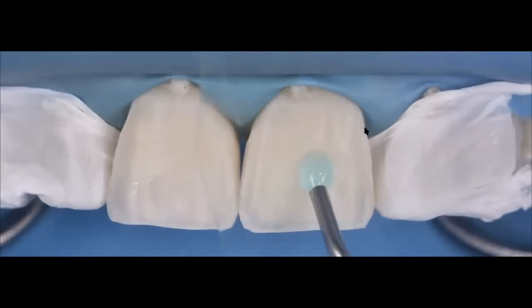And you can see here now I've removed everything. I'm adding a Teflon tape on one side. You can see here on 7 and 10 Teflon tape, and right between 8 and 9 I'm using a Mylar strip, and I'm going to start with acid etching one of the centrals.